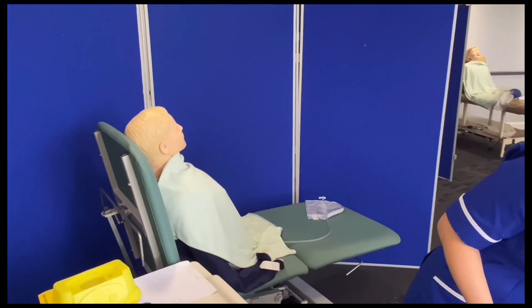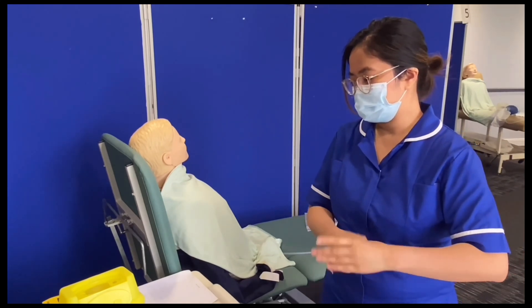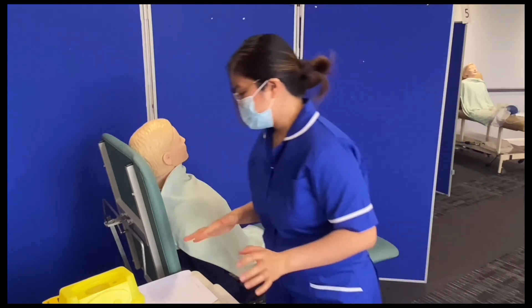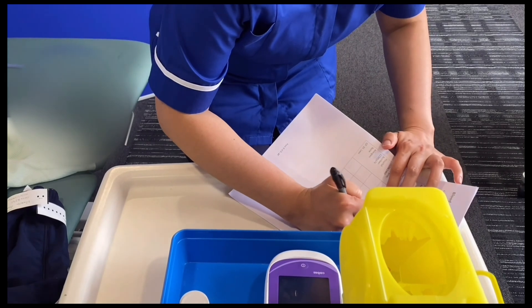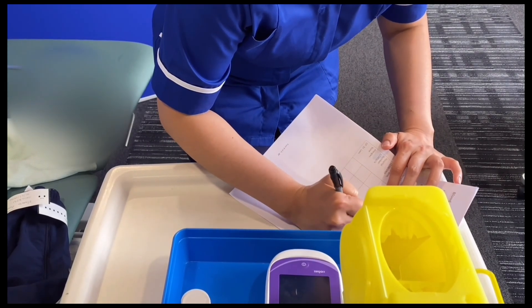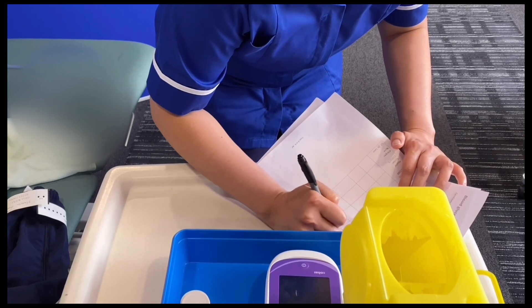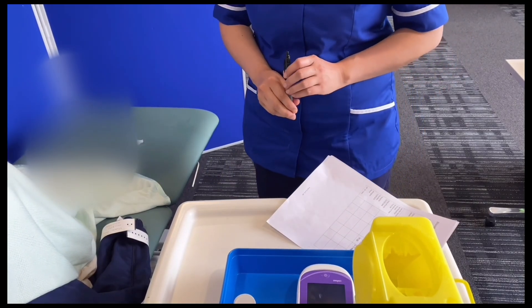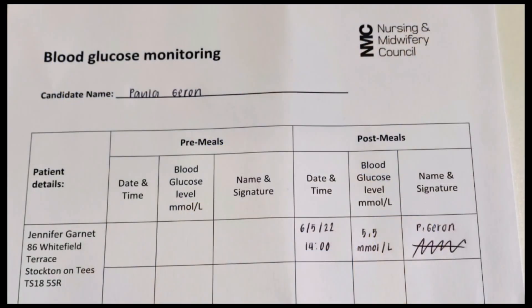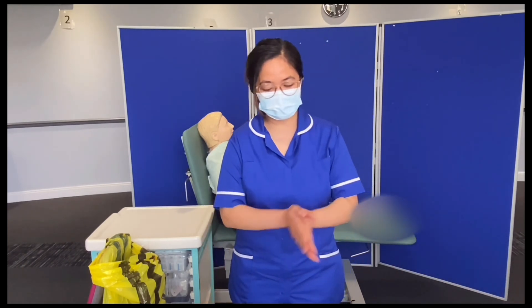I'll do my hand hygiene following the 7 steps of hand hygiene by WHO. Right Jennifer, I'm just going to document your blood sugar for today. I'll write the date and time — 14:00 — and your blood sugar is 5.5 millimole per liter, then sign with my name. So I've properly documented that, Jennifer — your blood sugar for 2 o'clock is 5.5 millimole per liter. Now I'm going to close my station by washing my hands at the sink or using hand gel, following the 7 Steps of Hand Hygiene by WHO.